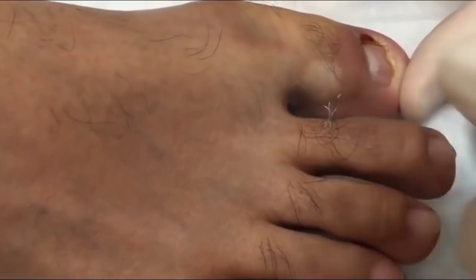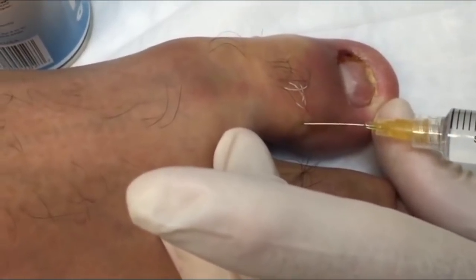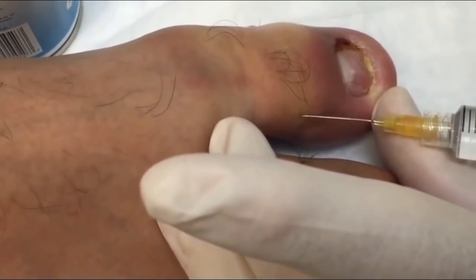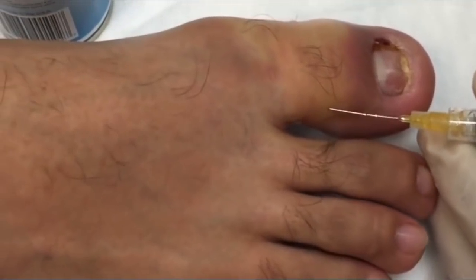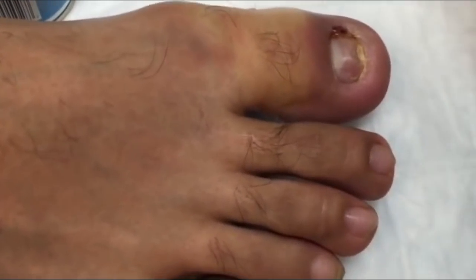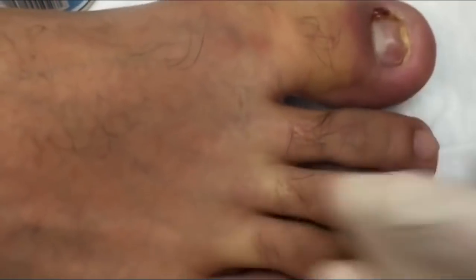Okay. So this is plain lidocaine, no epinephrine. No, I'm just kidding. No, we don't use epinephrine in toes. I mean, that's just bad form. Okay. You doing all right? We're slowly putting the medicine in. Okay. So we have our lidocaine injected in a digital block, and this will take a good 10 minutes to work, so we're going to stop here, and then we'll resume momentarily.